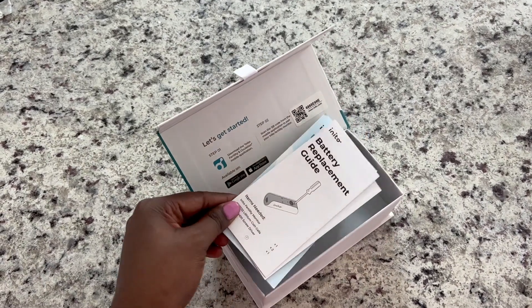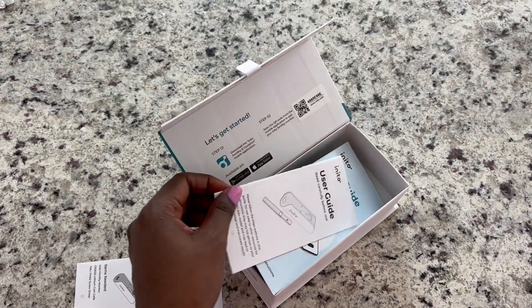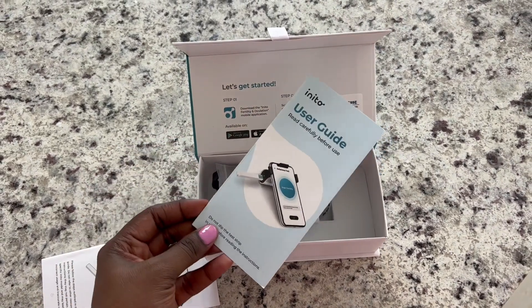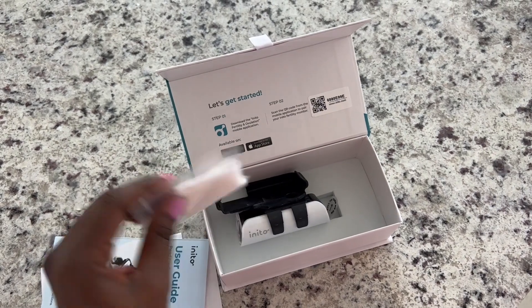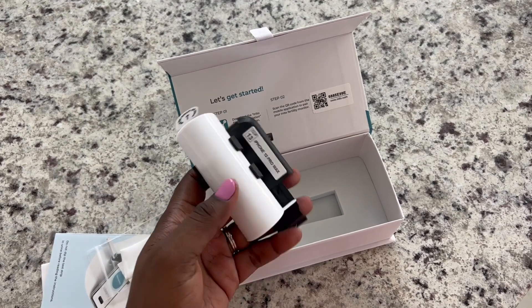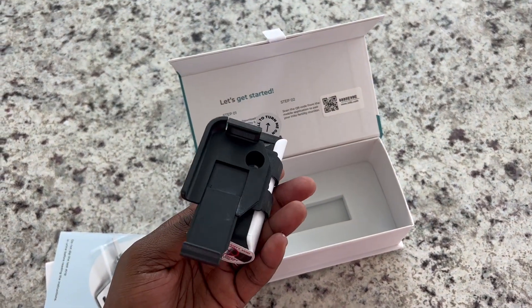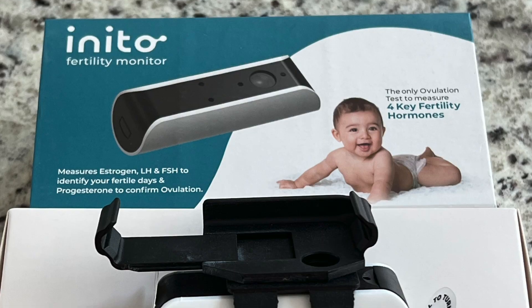Let's take a look at what comes in the fertility monitor kit. Inside you will find the battery replacement guide, a user guide on how to use the fertility monitor and connect it to your phone, a little white cloth to wipe your monitor, and the Inito itself. This is the Inito fertility monitor — right there is where you would put the testing strip in order to use it.